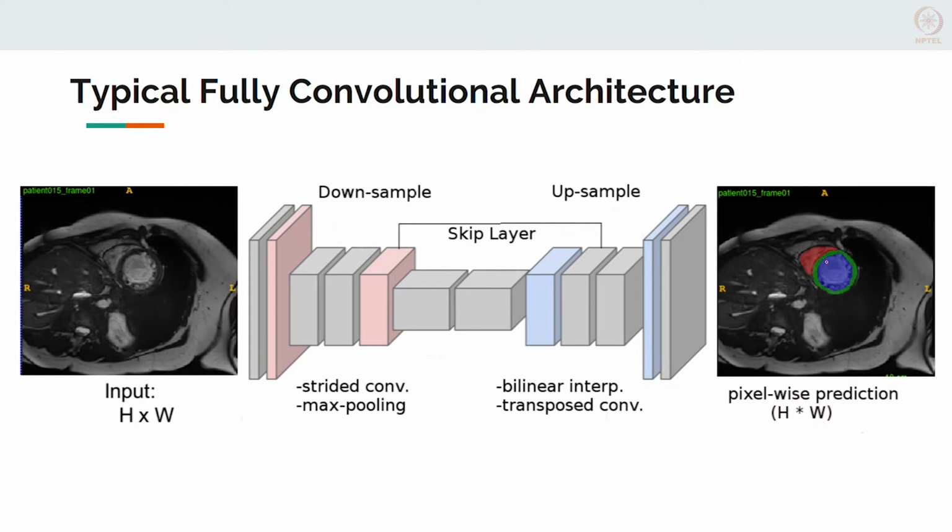In this case, remember the problem that we want to solve is the one corresponding to semantic segmentation. We have to figure out the class that every pixel belongs to, namely the green, which is the myocardium or the muscles of the heart, especially around the left ventricle, the LV cavity, this is the myocardium, and the right ventricle. These are the things that we want to label, because they carry the most diagnostic information.